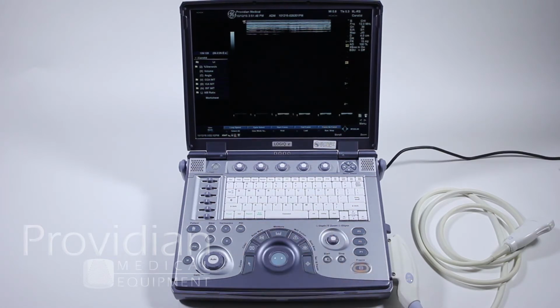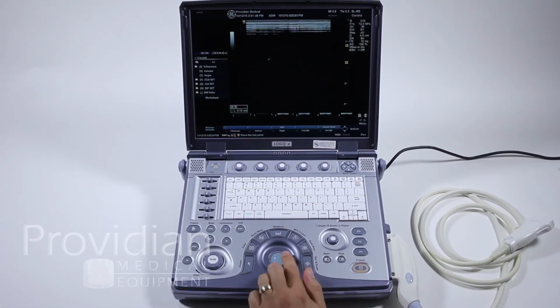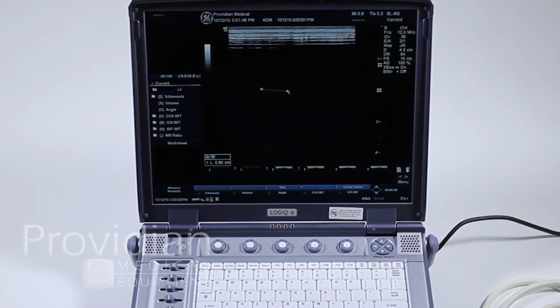So first we'll hit the measure and a caliper appears. Basic measurements are just simply hitting set and drawing the line and hitting set again. Before I do that, note that I can hit the measure key and go back and forth and make adjustments to the previous cursor. Once I get the image that I like, I can press set and it completes the measurement and the results box is in the bottom left.